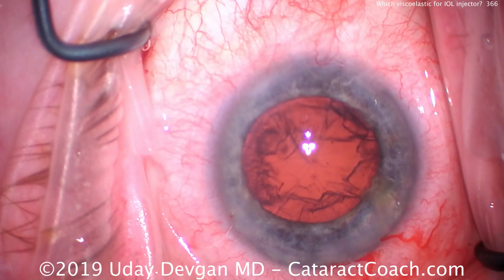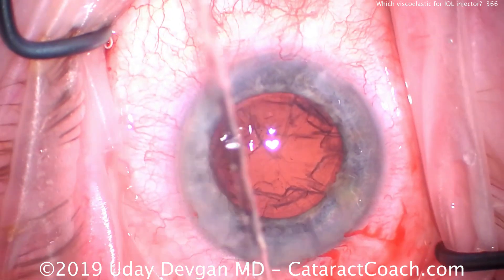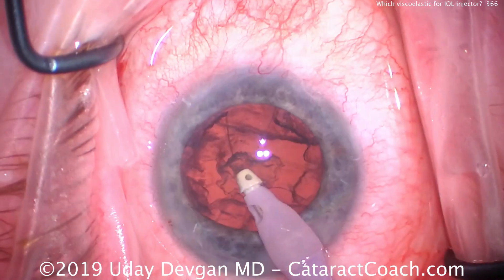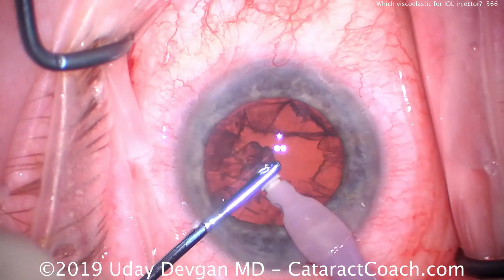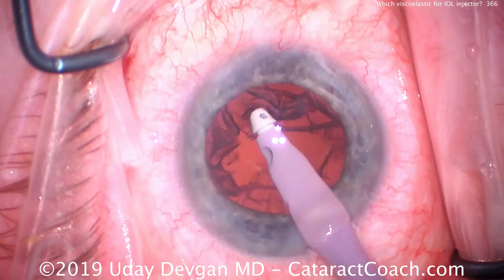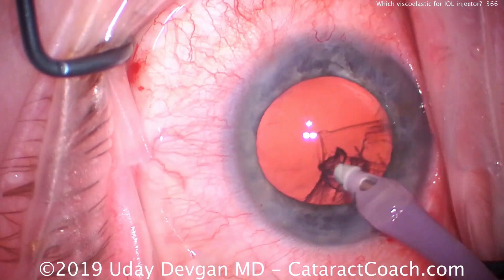We're going to finish up this case — the nucleus is already out and we're doing cortex removal. This case is proceeding very efficiently. This is the flip-and-chop technique where the nucleus was flipped out of the capsule bag and then chopped relatively quickly, and it can be emulsified quite easily.